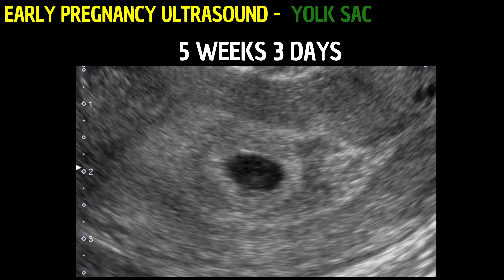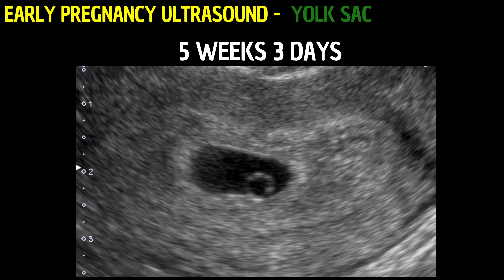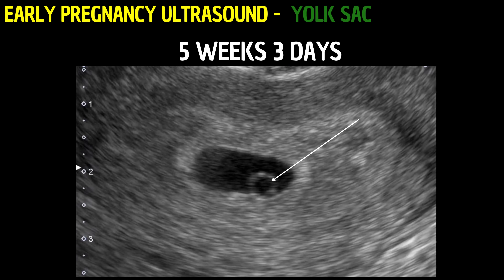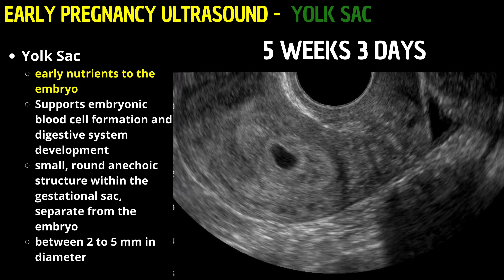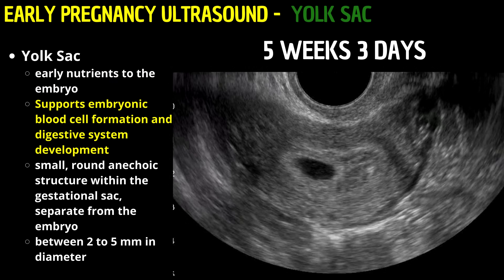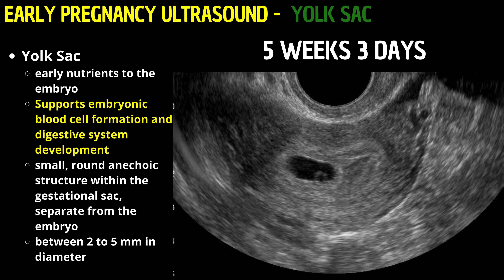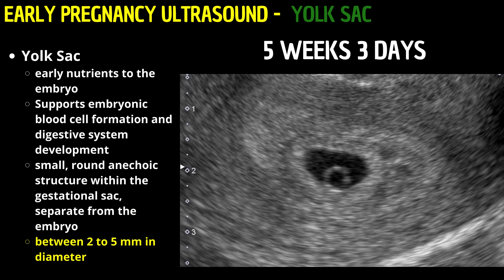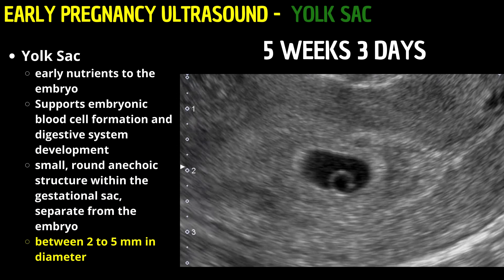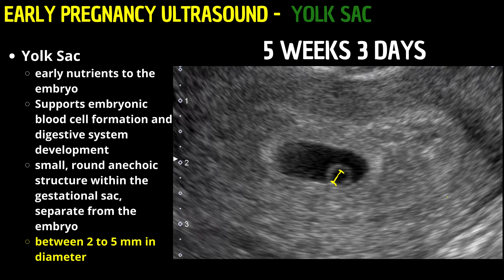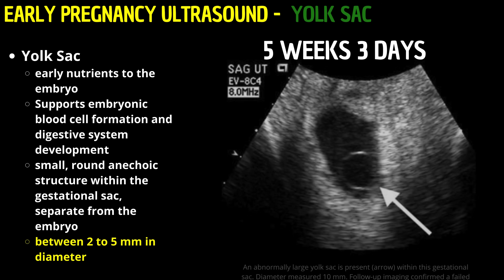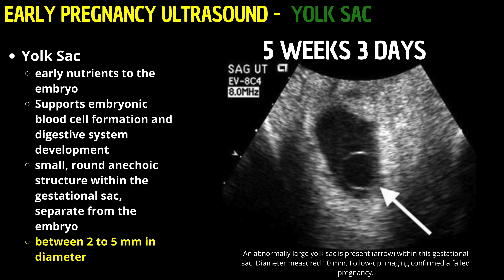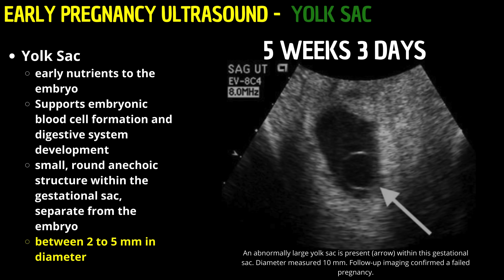Around five weeks and three days into gestation, we witness the vital development of the yolk sac within the gestational sac. The yolk sac serves as a critical nutritional and developmental structure for the embryo, providing essential nutrients and supporting embryonic blood cell formation. At this stage, the yolk sac is typically visualized as a small, round, anechoic structure within the gestational sac, distinctly separate from the embryo. Its diameter usually measures between 2 to 5 millimeters. A yolk sac significantly larger or smaller than expected, or one that appears irregular rather than round, may suggest chromosomal anomalies, embryonic developmental delays, or an increased risk of miscarriage.